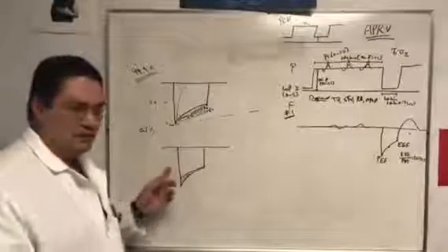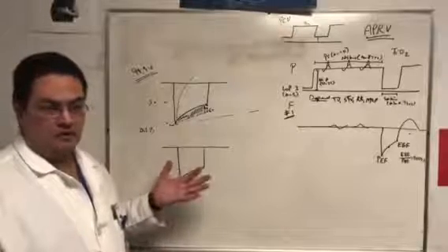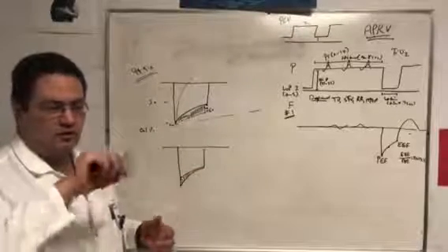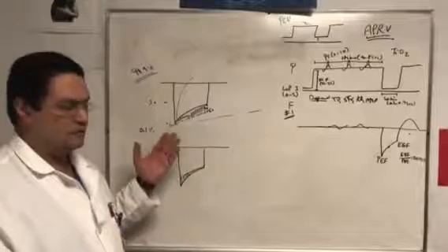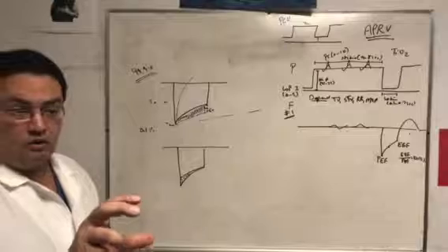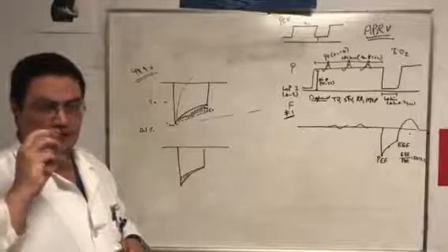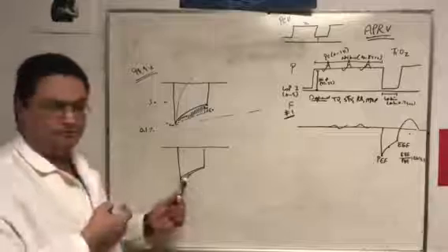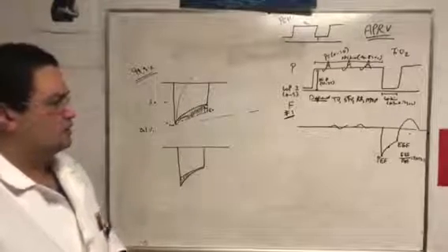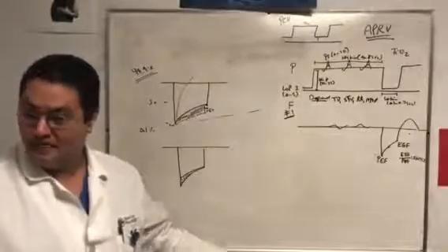But the 0.1% of the obstruction that we say it's obstruction, it happens because of the upper airway. You know, the mucus plug or the tube is kinked or something like that. If that happened, that's what you're going to see, and you're probably going to recognize it right away. Or if you're still using the HME filters, many times the filter clogs and gives you this pitch. All right? So that's that. That is it, madam.